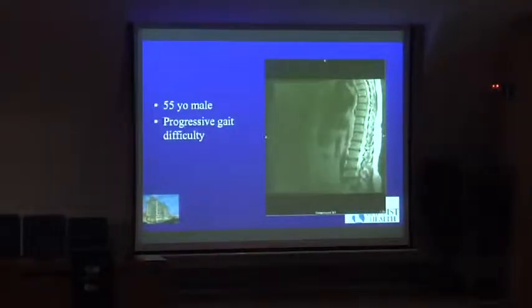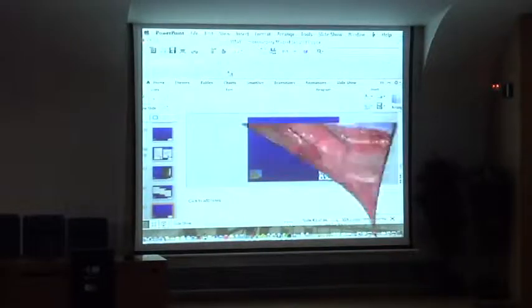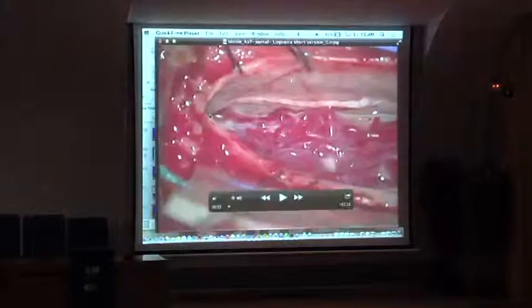We still believe that for simple spinal AV fistulas that fail approach by endovascular, surgery is a very good option. This patient has a potential of two feeders. There was a questionable T6 and a clear T5. This patient had a perforation issue in attempting to embolize this fistula, and the fistula remained alive. So the decision was made to take him to surgery because of the problem and failure of the endovascular attempt.